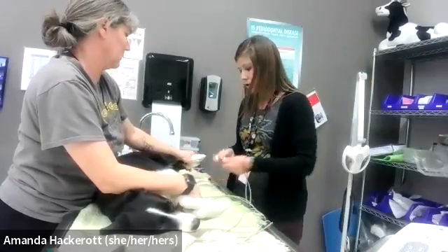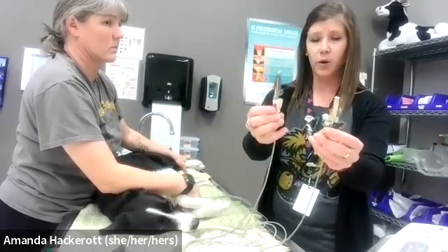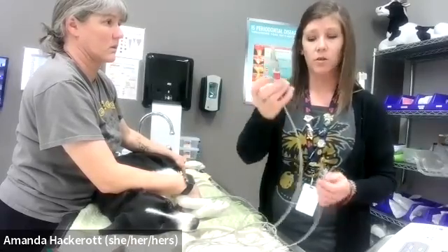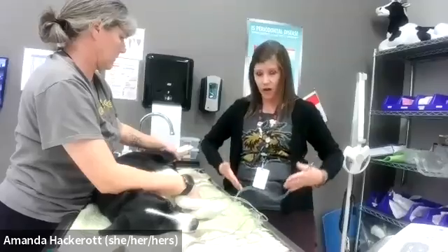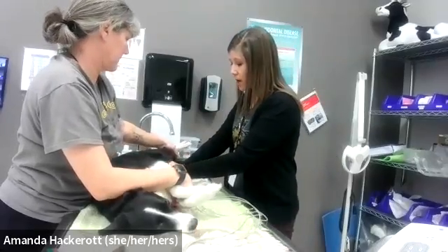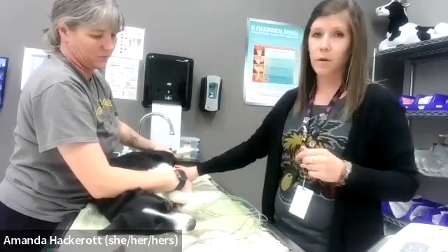Our last two leads are red and green — this is our Christmas colors. We're going to match these up in the appropriate way. Red is going to go with the black color, so this is going on our left side, and I like putting it in the inguinal area, just right in here. Though your textbook does say to put it right on the point of the knee, that again is not terribly comfortable for our pets.